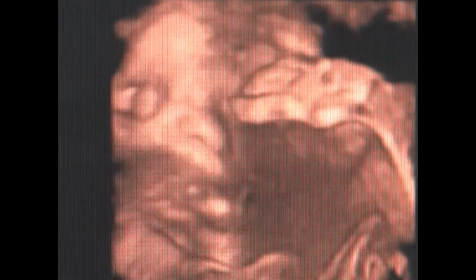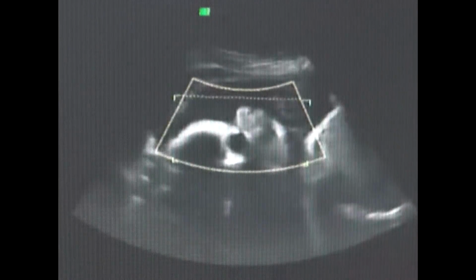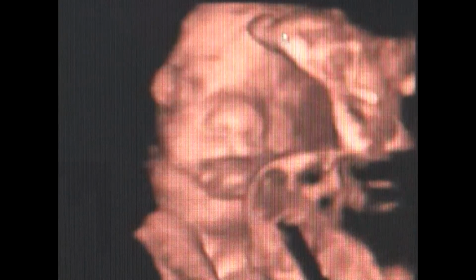But she knows feet in her face. She can do that. She can move the umbilical cord. Right? She's very flexible, obviously. Isn't that cool, Braxton? Almost there. This is the knee. And there's a toe up at the forehead. Up at the forehead.